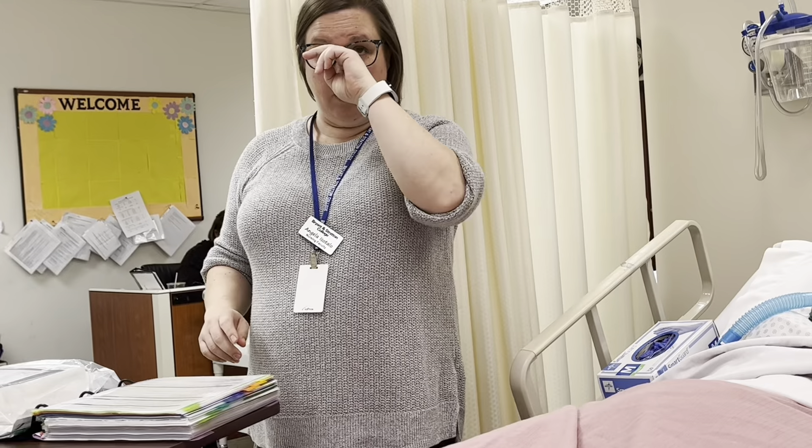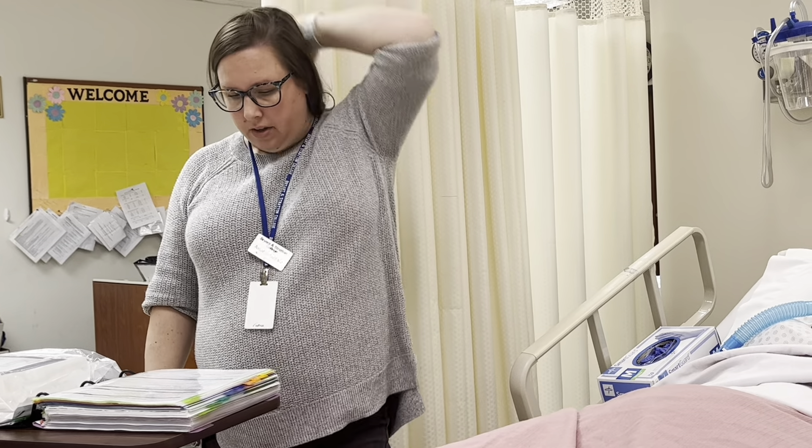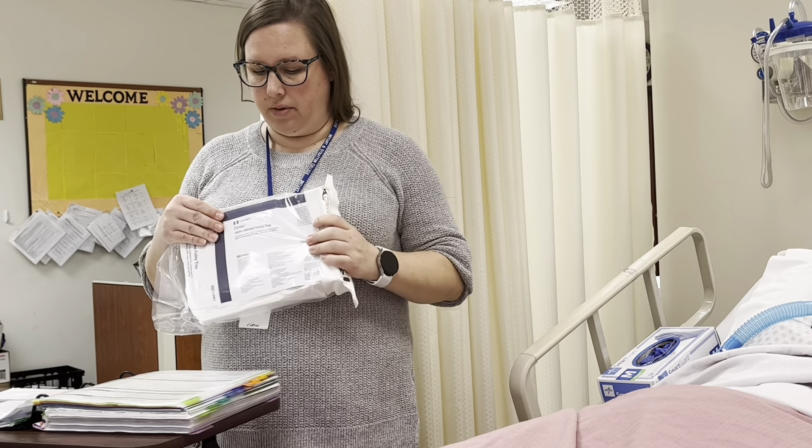I'm going to review the patient's chart for any previous catheterizations or any impairments or pathological conditions that would cause impairment of the catheter. I'm going to review the orders for medical necessity. I'm going to ask my patient and look in their chart if they have any allergies to iodine and latex. I'm going to gather my supplies, which is the Foley catheter kit.